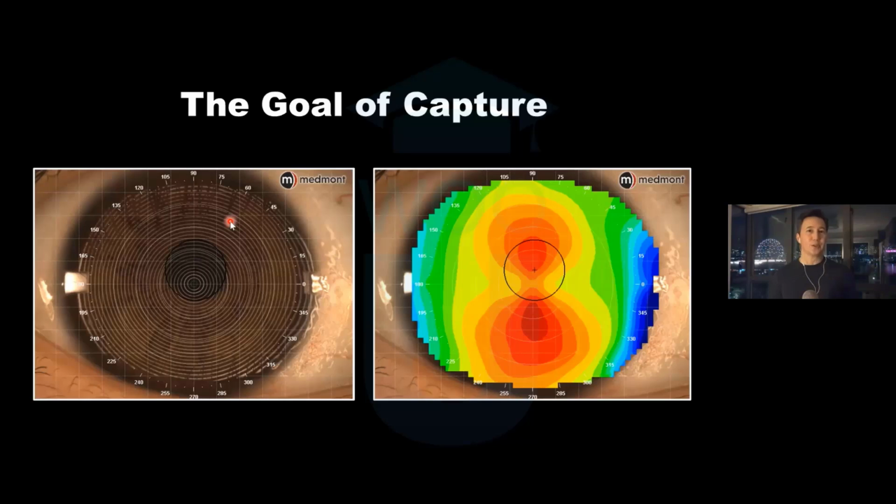I have the patient blink every 4 seconds to ensure that we have good tear film quality. Put in an artificial tear if the tear film breakup time is measured in a second or milliseconds, but just blinking more often may be the trick that you need.